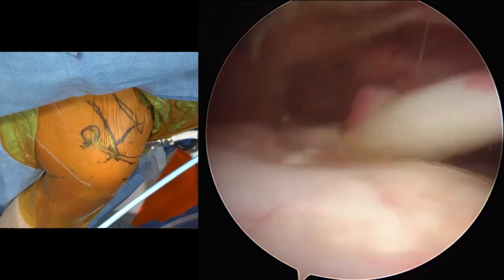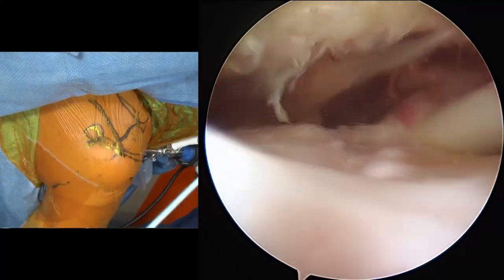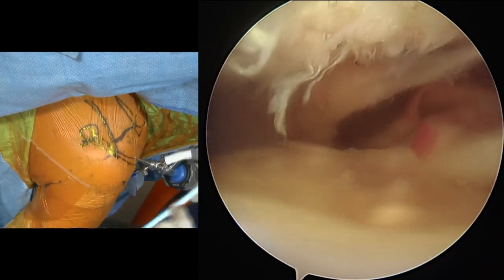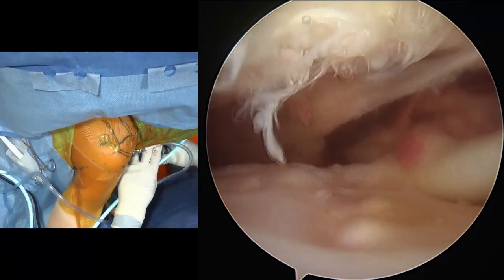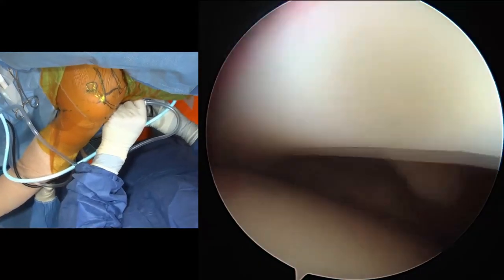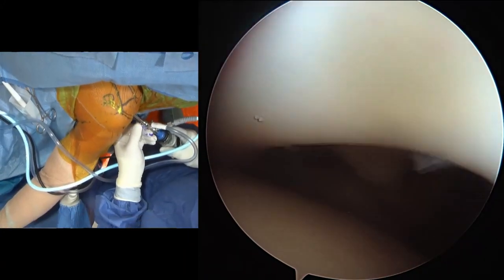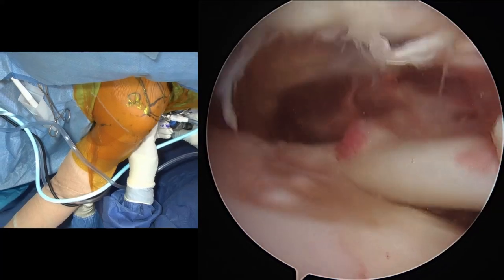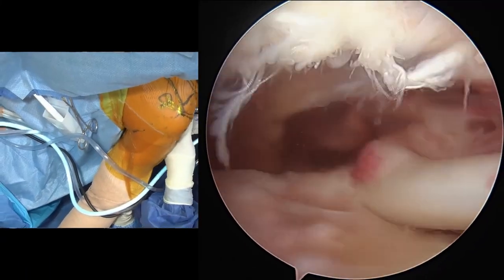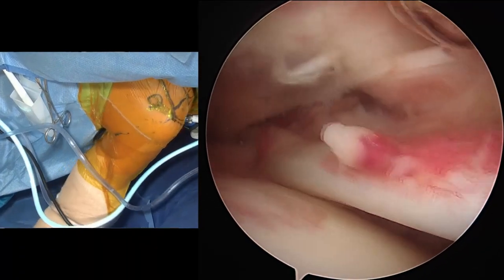Go ahead and hold the arm and pull on that. And it looks like we have more than a partial tear, but a full thickness tear involving his rotator cuff tendon in this area here. We'll get a better look at that in just a minute, but we can see this also involves the biceps tendon. Here's the biceps exiting the glenohumeral joint, and we can see the tear of the supraspinatus has lifted the lateral stability of the biceps. That edge is just being caught right there. And that's part of the reason why he's having so much bicep symptoms.